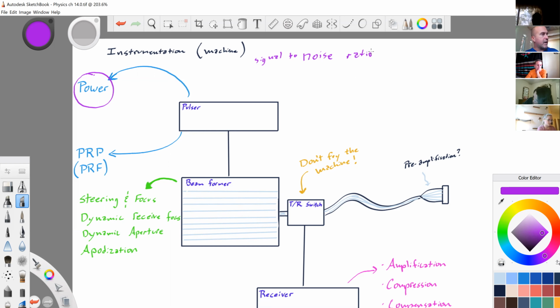Other things we can call the power output: gain, which is a no-no, don't call it that. Acoustic power, pulsar power, energy output, or just power in general. We don't want to use the term gain. Gain is listening. When you turn up your gain, you're not turning up the power, you're turning up your listening. You're getting your ear closer, in a sense, or cupping your ear with your hand to hear better. That's gain. So don't ever use gain for power, and in fact, you'll never see it written like that. Power is power.